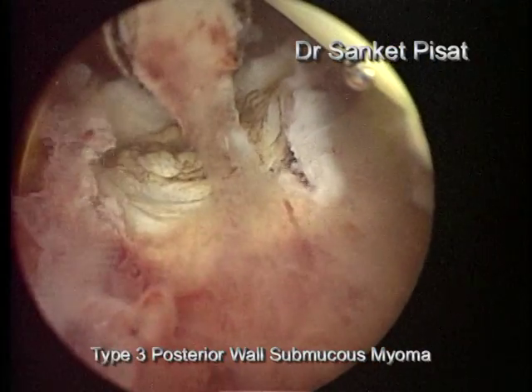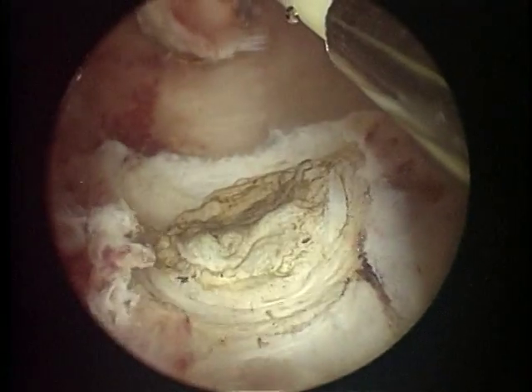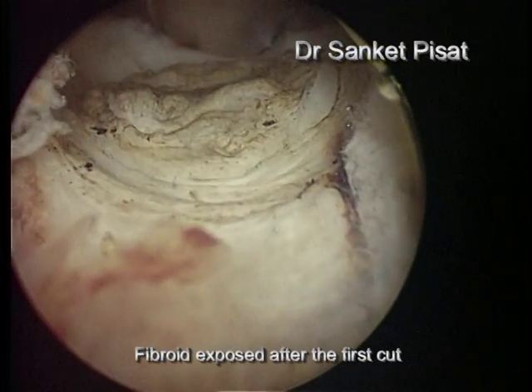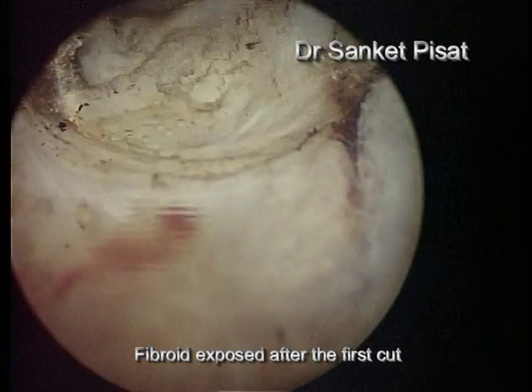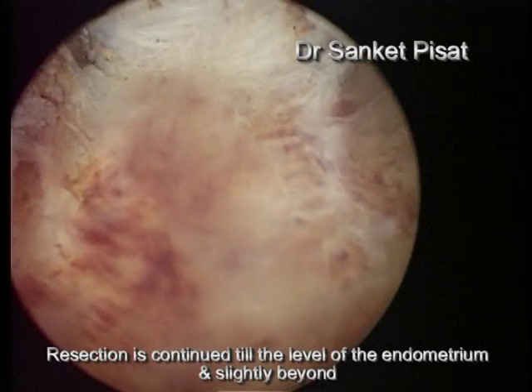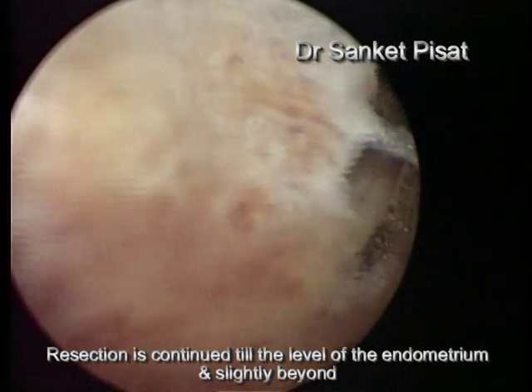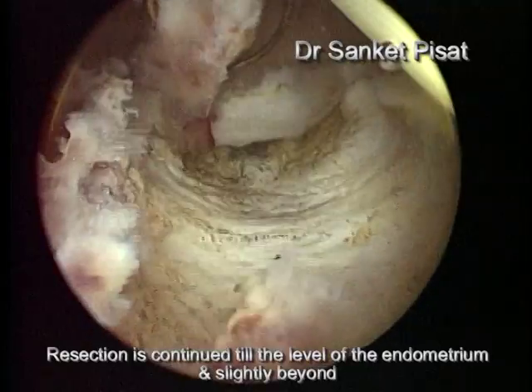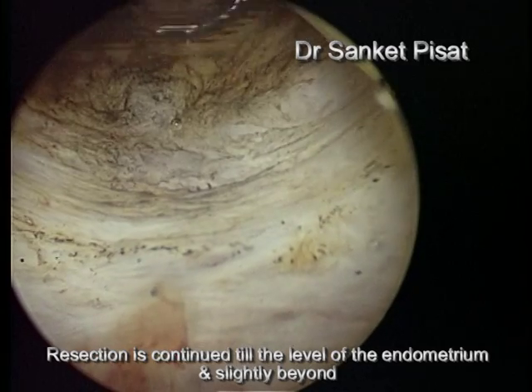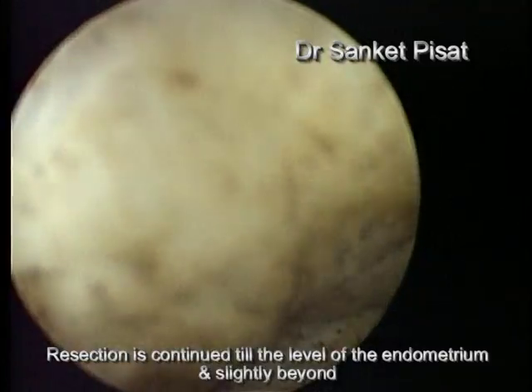The fibroid is only slightly jutting or touching the endometrial cavity, but most of the fibroid is still within the uterine wall. It is only after the first primary cut has been made that the fibroid is seen. Notice the difference in color and texture between the myoma and the surrounding normal myometrium. Resection is continued, taking 2 or 3 successive cuts until the fibroid is flush to the level of the endometrial lining, or even a little deeper, till the surgeon feels comfortable to continue the resection.